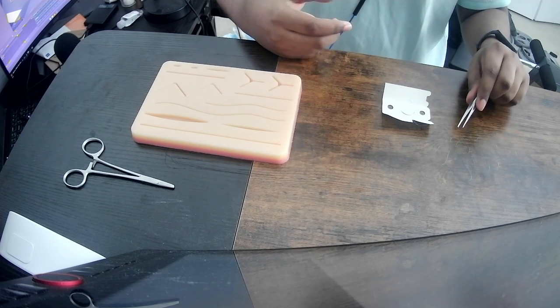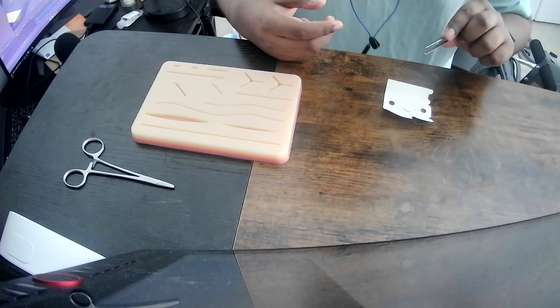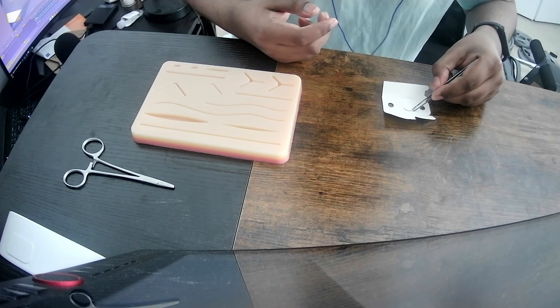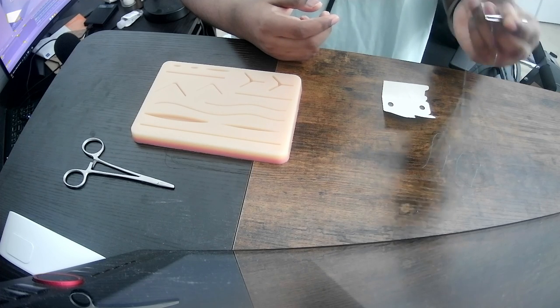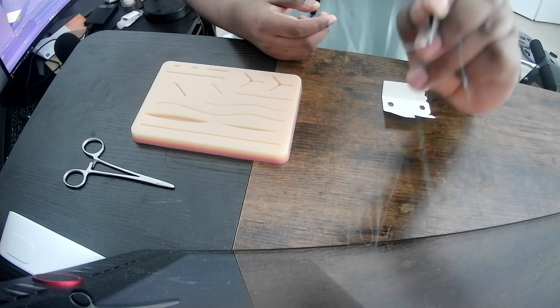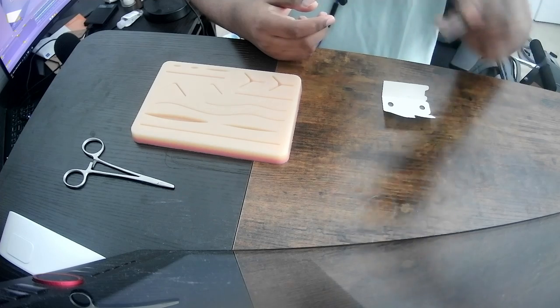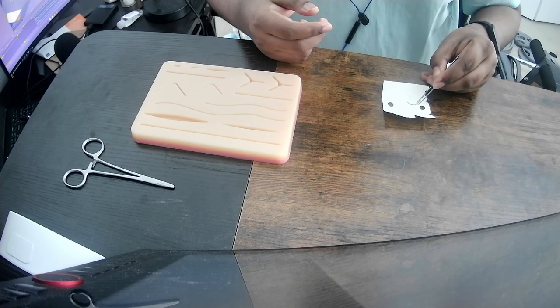Isn't loaded and you have to pick this up off the ground, you can kind of see how I have it wedged right in between those teeth. Yeah, I did it. Actually pretty secure here. It won't fall out easily. So I have a lot of control over the needle. It's not going to slip. Nice. And now I'm free to load it into my driver.